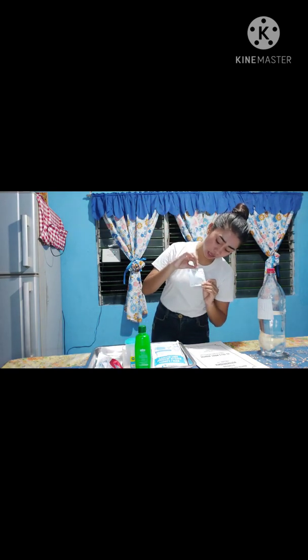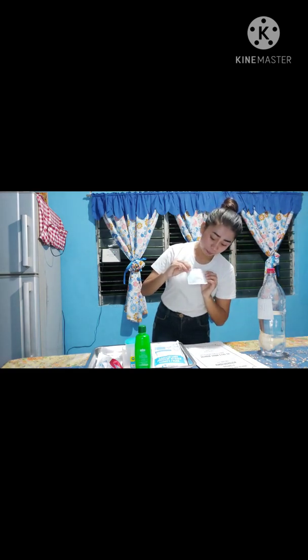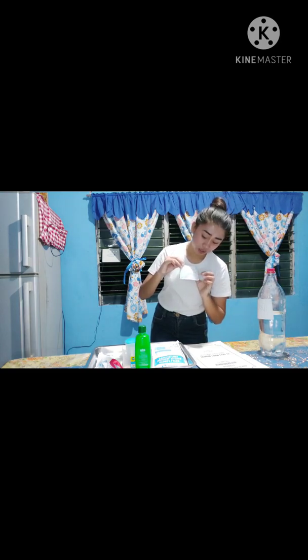Then the next step is to check the information label on the solution bottle to make sure that the correct solution is being prepared, and then we should also check the IV tag or the label where it states the name of the hospital, the name of the patient, the room number, the name of the IVF, the medication infused, if none, write none, the IVF rate, the date today, the time, and the name and signature of the nurse that is assigned, or the one who assists the doctor or the IV therapy nurse.